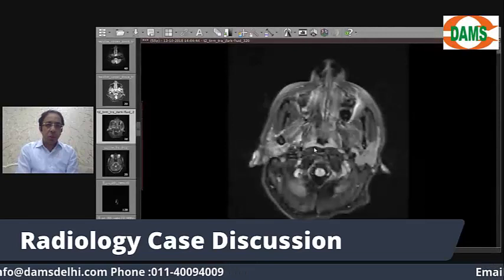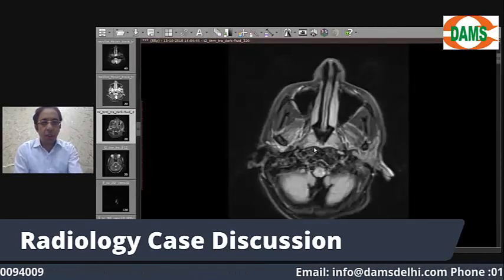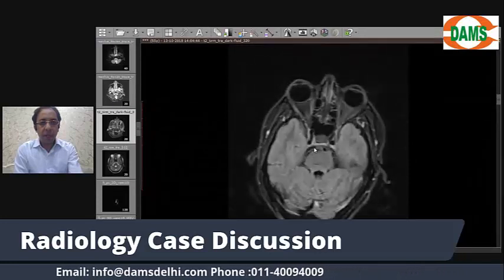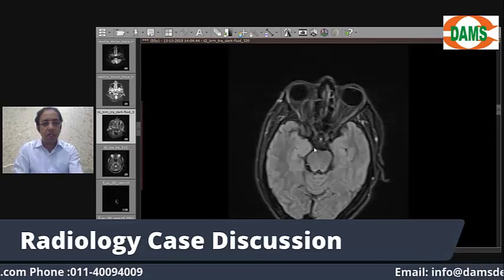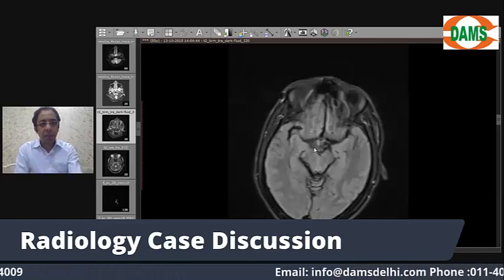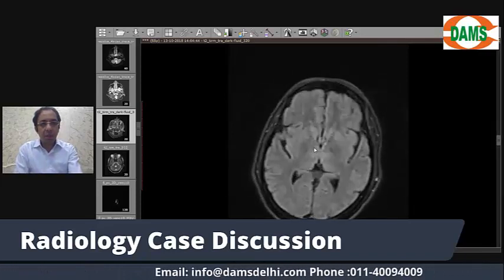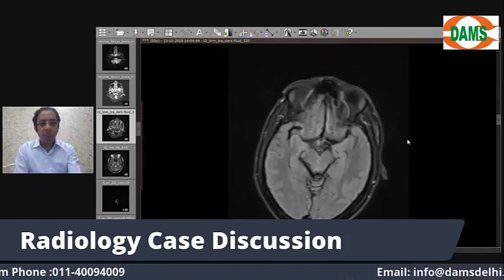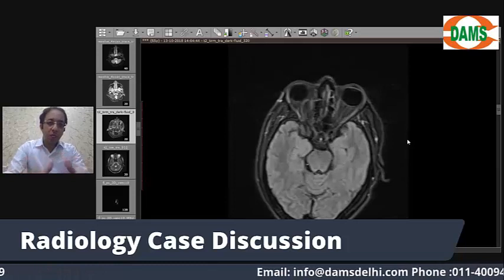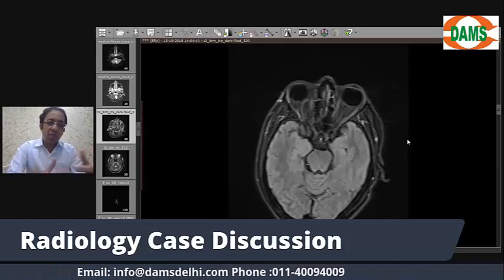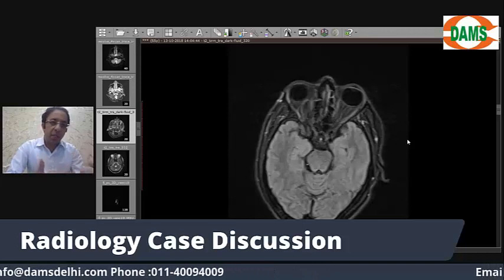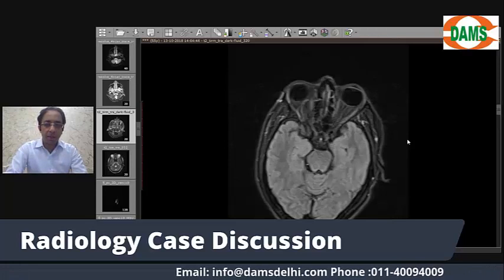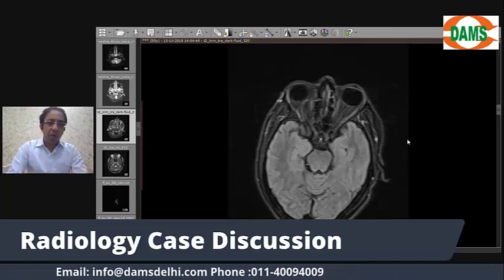Let's also look at the FLAIR images. Tracing the axial sections from below upwards on FLAIR, there is no abnormality visible. There is no vasogenic edema — only cytotoxic edema, meaning only the infarction we saw on DWI and ADC. The FLAIR images show no abnormality.